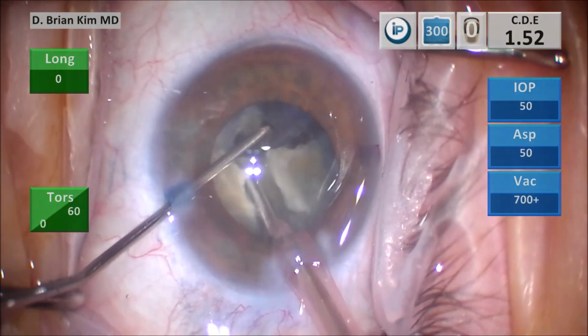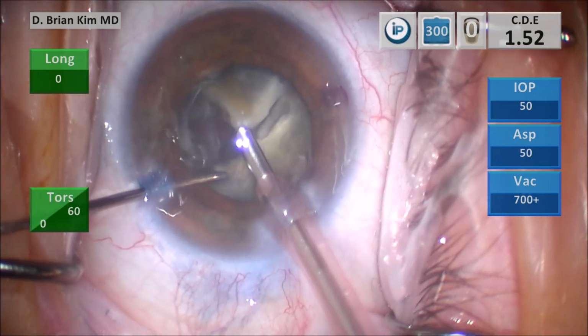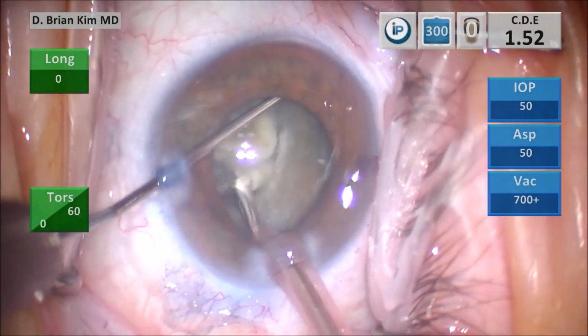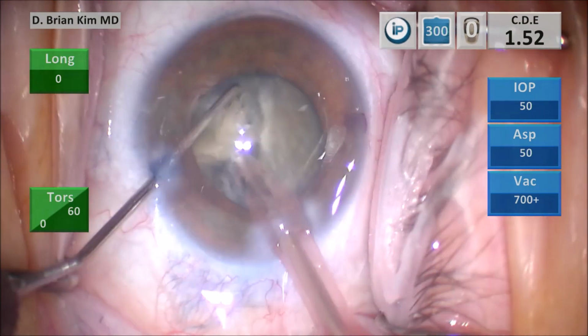So you can see the second quadrant still attached a little bit. And so I'm just rotating the lens very carefully. Thankfully, the lens is spinning pretty easily. I'm placing the chopper around the lens to separate that second quadrant from the rest of the lens there.